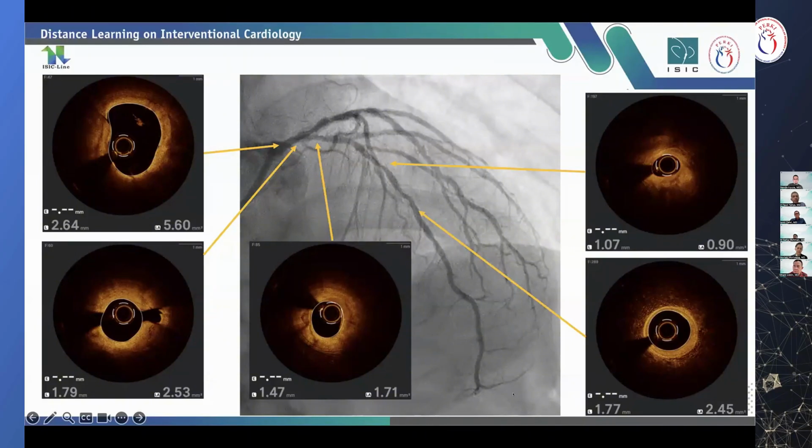Okay. So do you think that when there is a significant FFR but no pressure jump, OMT still plays a role with such a left main disease? Or are you thinking it is better to send the patient to CABG or do another strategy? Dr. Noriaki, I mean, that's functional, but no pressure jump. That's the question, because this is diffuse disease.